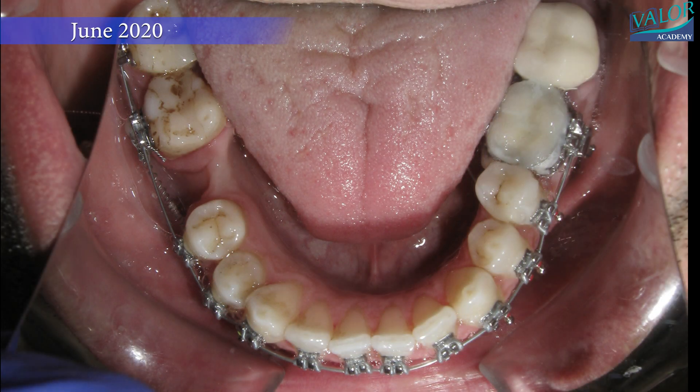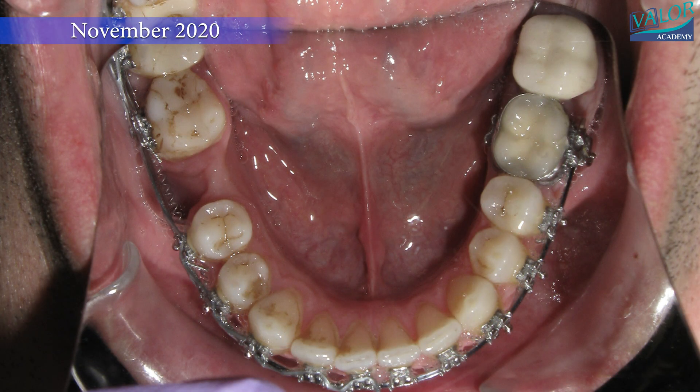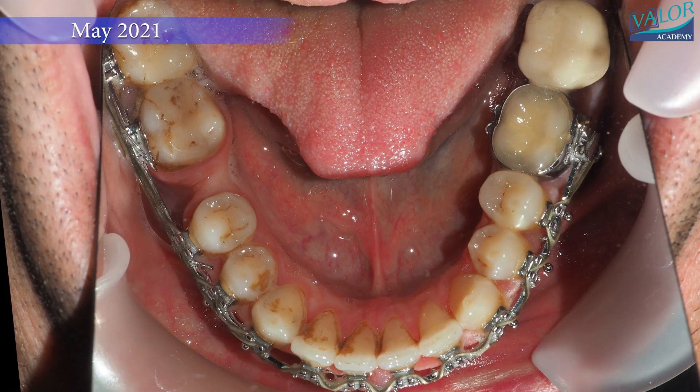Typically, such treatments take around two years, but in this case it extended to four years due to the need for a 12 mm lower molar protraction to create space for osteotomy lines behind the molars.